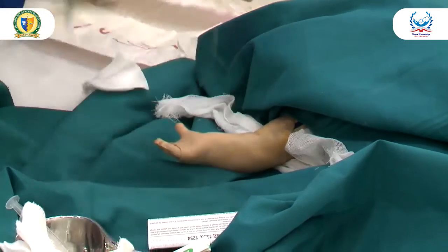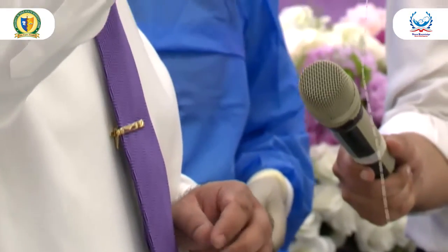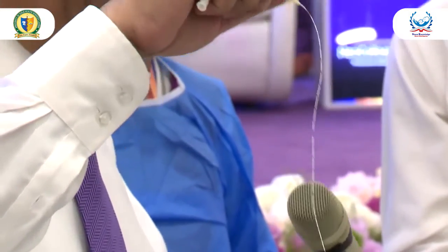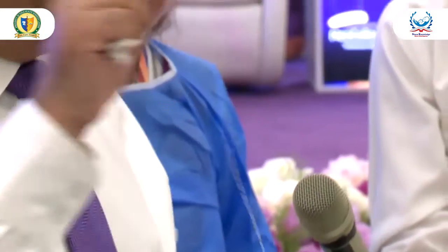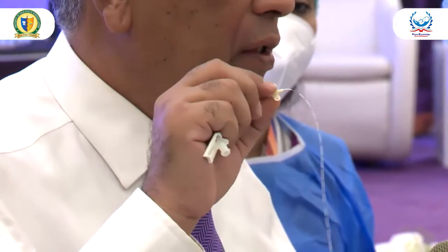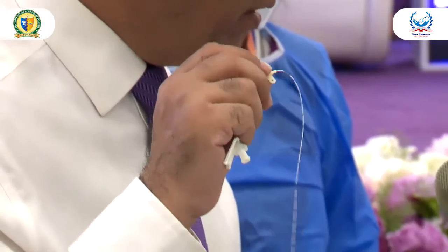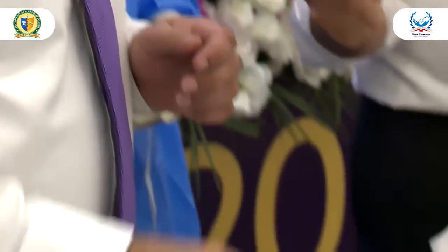So the point is, if you cut it in this scenario, cut it at 6 centimeter and put it in the notes, that rest is 14. So that at the end, after a week or 10 days, when I take it out, I will see that it is 14 centimeter. It has to be 14 centimeter. But there are certain other these long lines, especially of silicone.